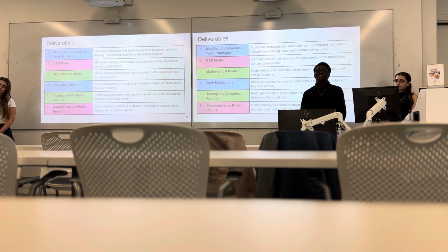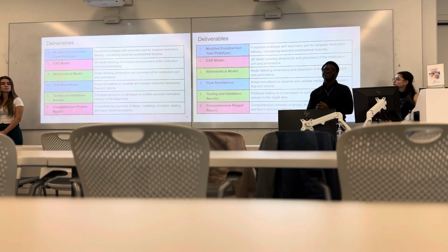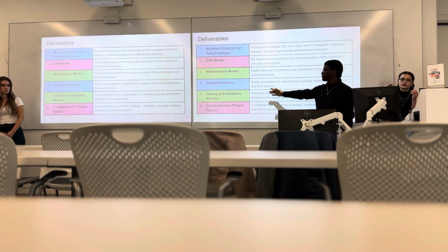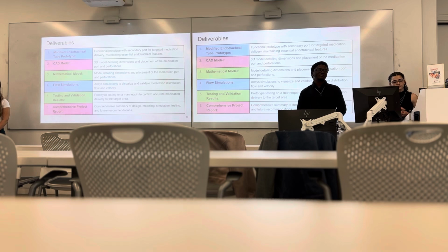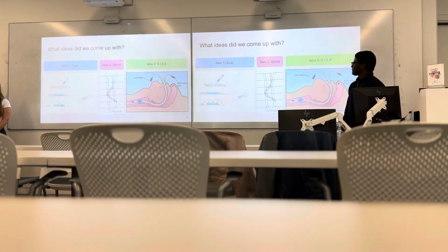A flow simulation that allows us to visualize the flow as well as verify the exit velocity to make sure it's enough to reach the back of the throat, the trachea. We did do physical testing, as well as we're gonna have a comprehensive report that explains our design process from beginning to end. So how do we actually tackle this idea?